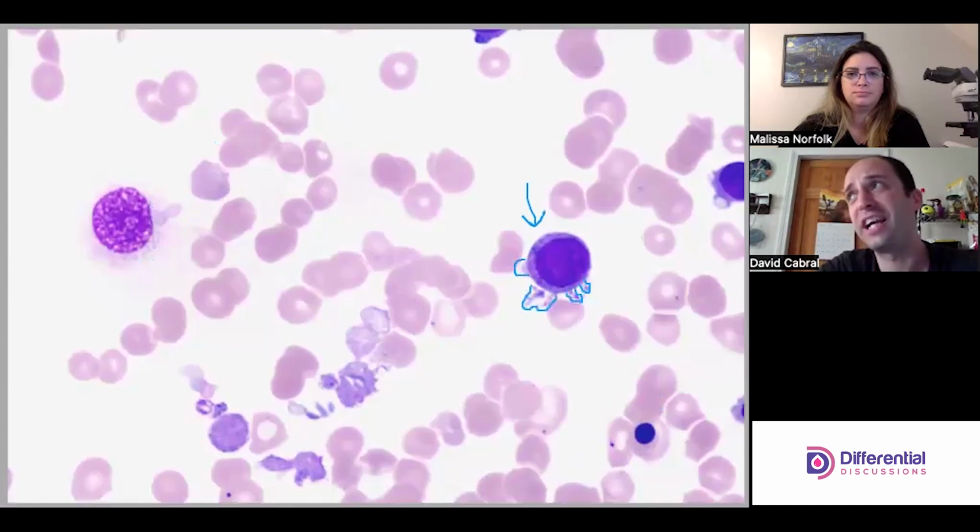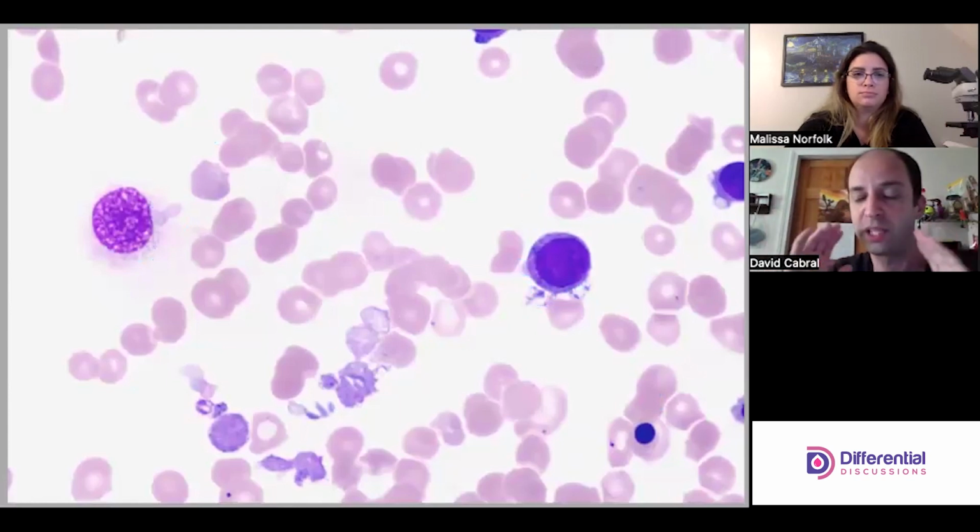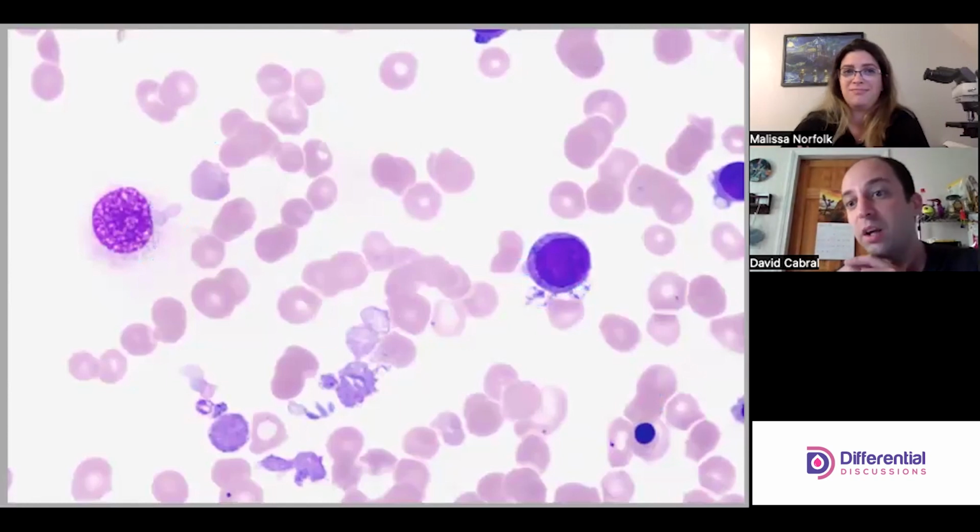So I don't think I've ever seen a hairy cell that had really abnormal wonky platelets. But yeah, those little flyaways off of the membrane appear to be platelets forming. I'm going to call them platelets. Little blebs. Yep. Bleb is a scientific term, and it makes it a little bit easier.